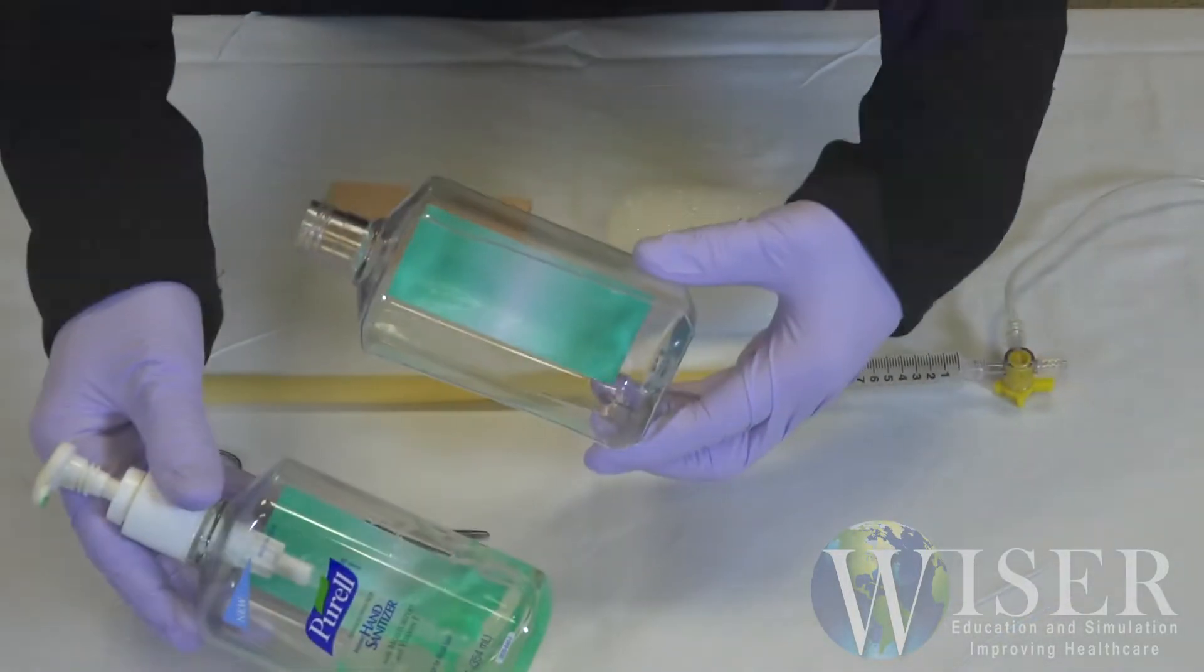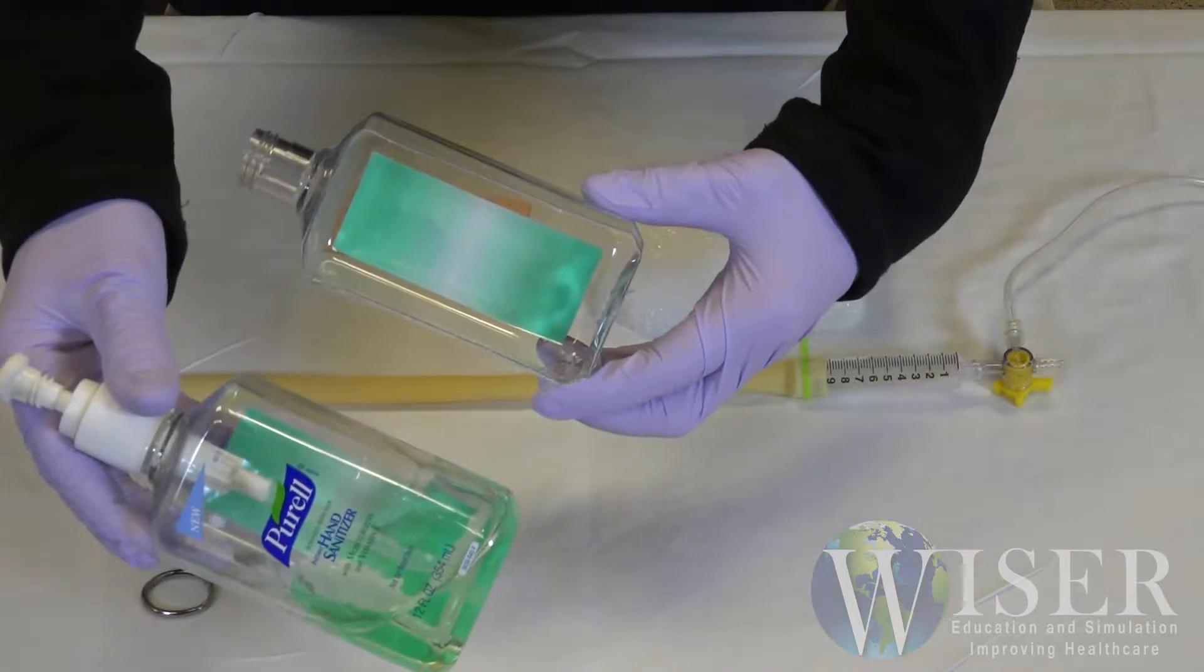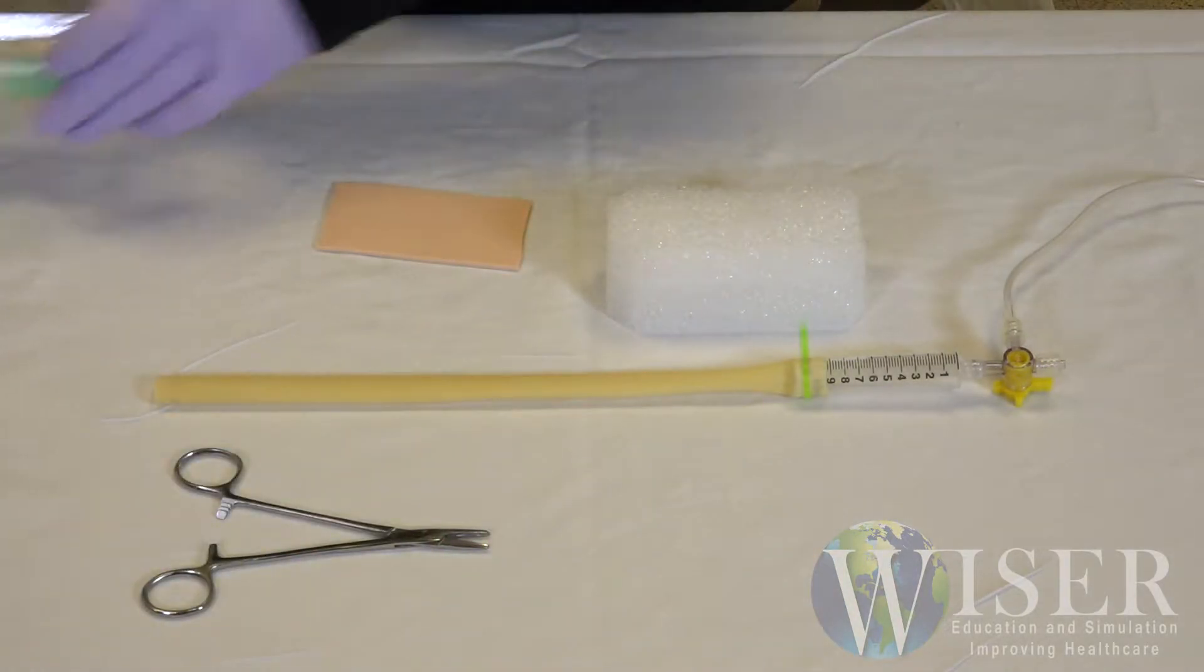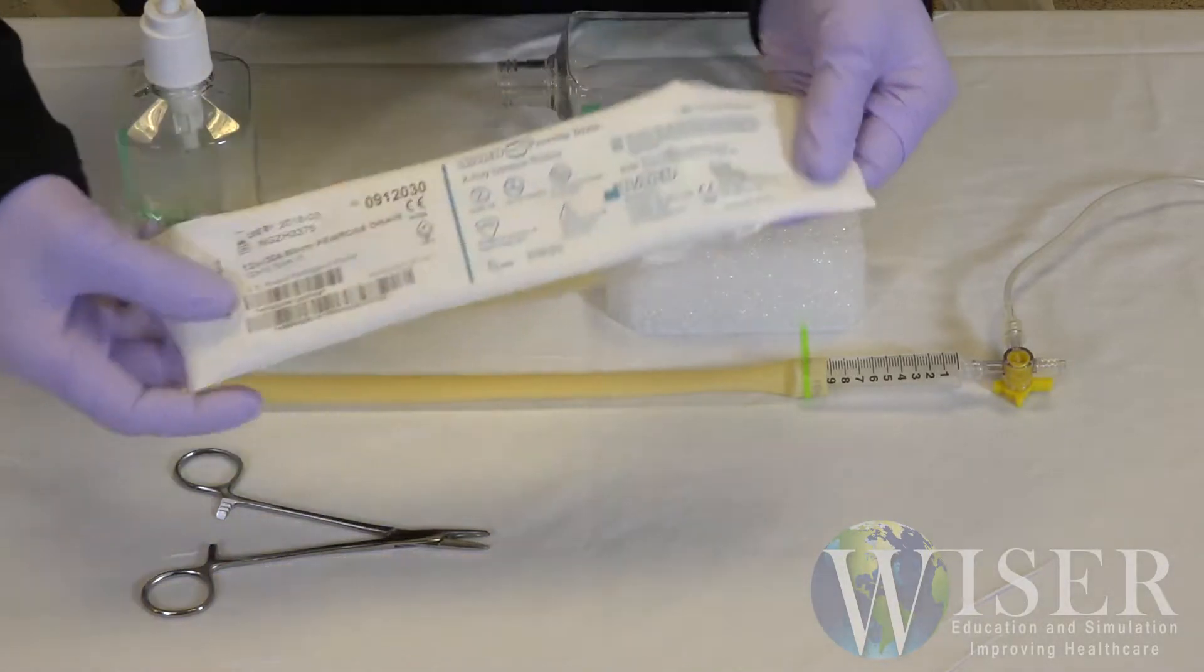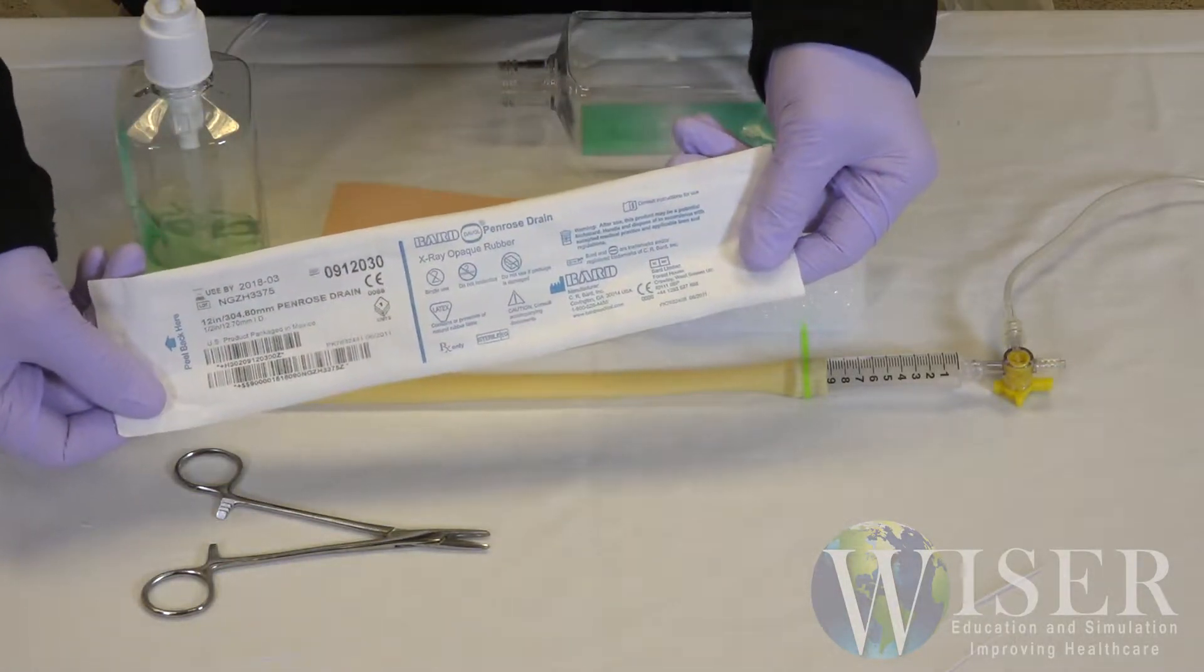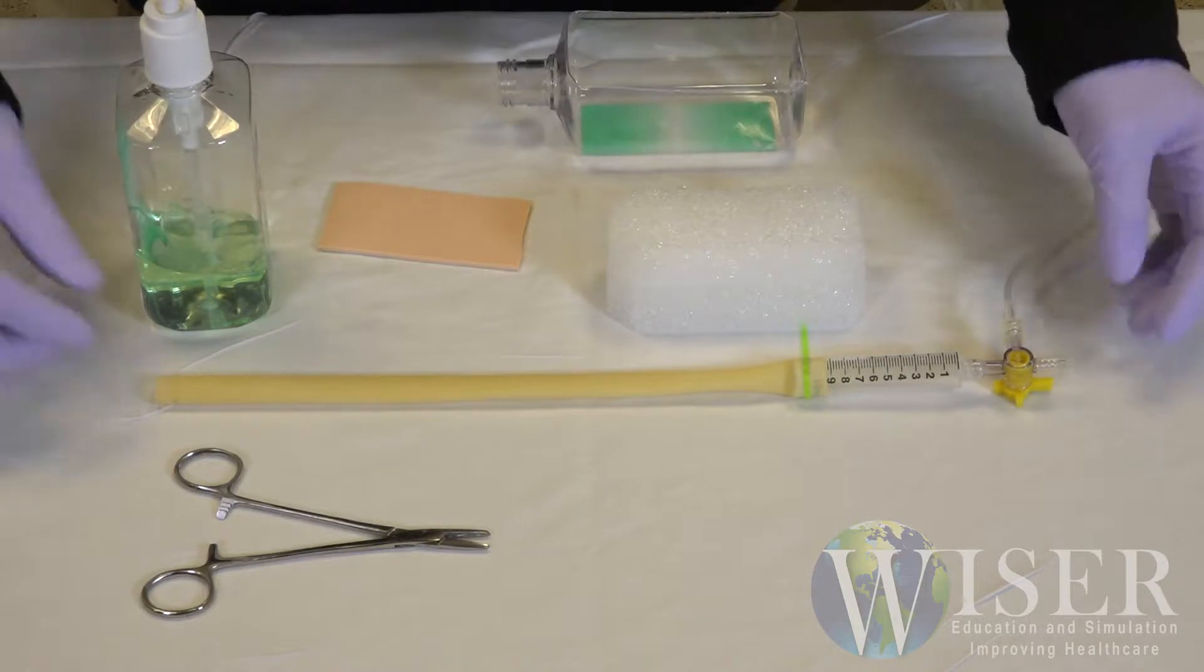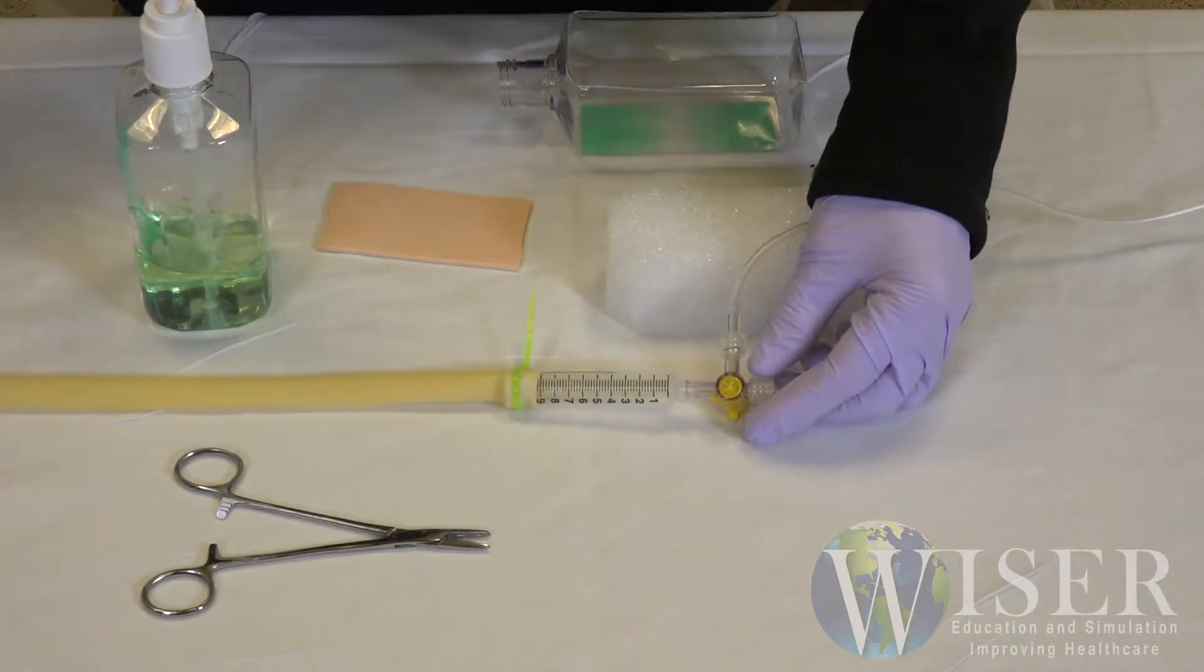This affords students deliberate practice with this technique used in many procedures, such as central venous catheter placement. It consists of a piece of Penrose drain filled with fluid and suspended in foam. This represents a blood vessel.